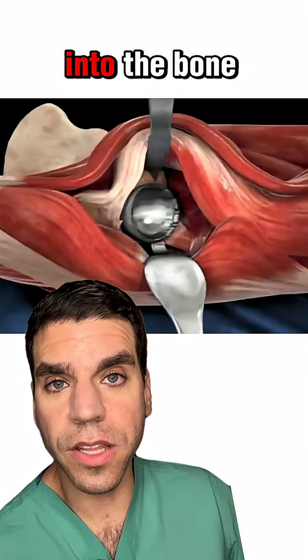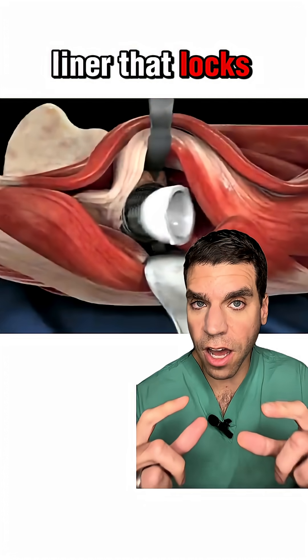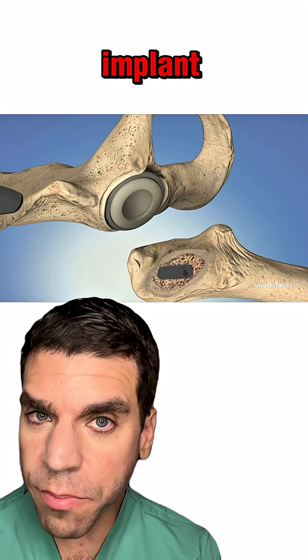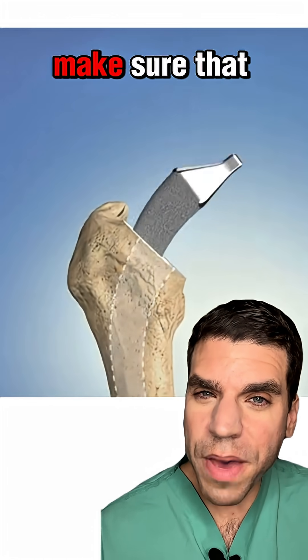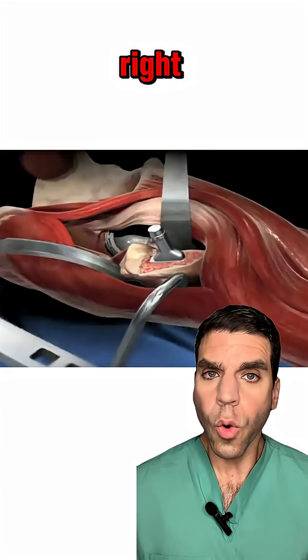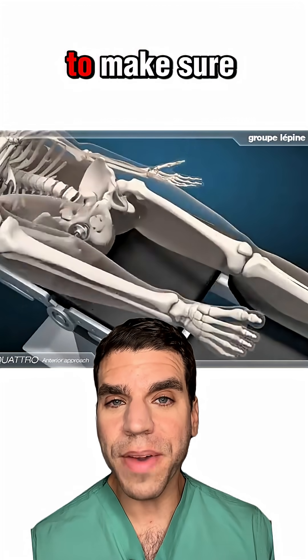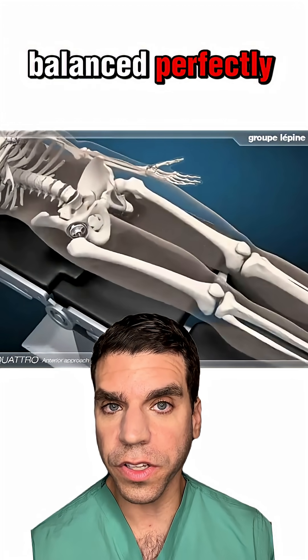Then we place a metal cup into the bone with a plastic liner that locks inside of it. Next, we shape the inside of the thigh bone to fit the implant. We test a few sizes to make sure that it fits just right. We pop a ball head onto the stem, put the hip back in place and move the hip around to make sure that everything is balanced perfectly.